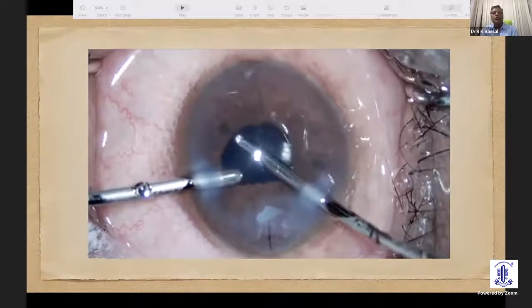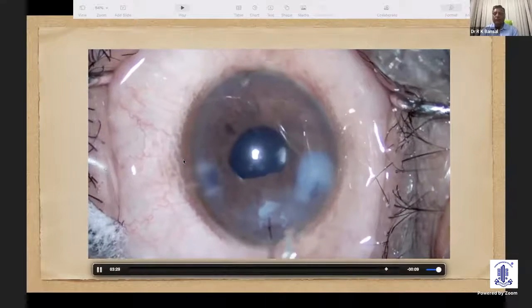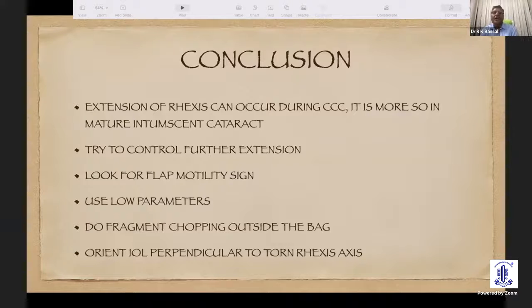One can achieve a nice IOL implantation even if there is extension of the rexis. Extension of rexis can occur during CCC — it is more common especially in a mature intumescent cataract. We should try to prevent further extension of the rexis. We can look for the flap motility sign to confirm that extension has not reached the posterior capsule. Use low parameters so that fluid pressure is not exerted on the capsule. Always try to do fragment chopping outside the bag, and always orient the lens perpendicular to the torn rexis.